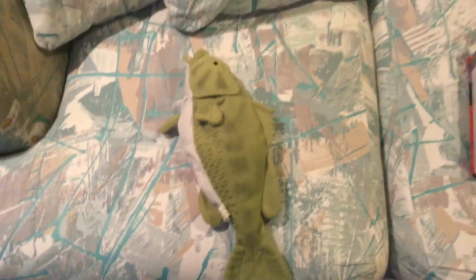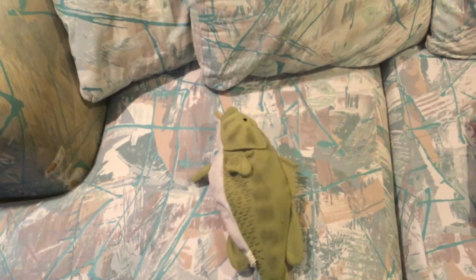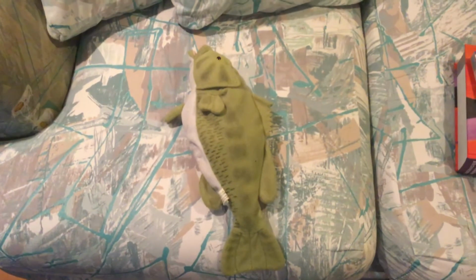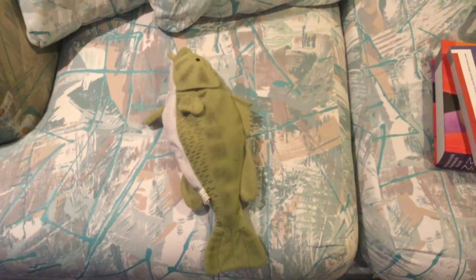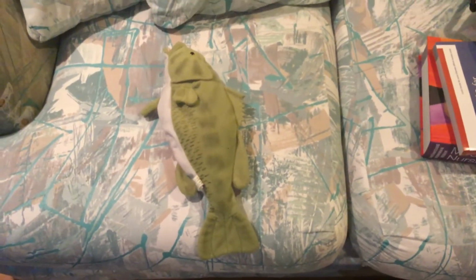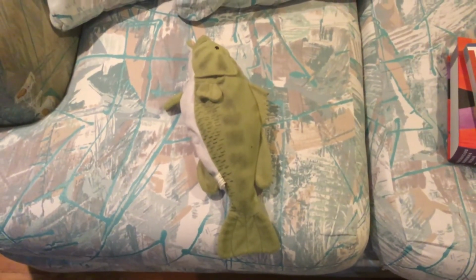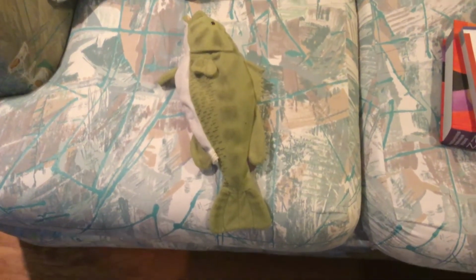I will identify expected outcomes, know the actions, special nursing considerations, safe dose ranges, purpose of administration, and adverse effects of medications to be administered. I'll check with the pharmacist regarding substituting tablets, gel caps, capsules, or sustained release medications for liquid form. Ensure that the contents of capsules can be expressed from the covering. Identify what teachings I might need to provide to Steve.